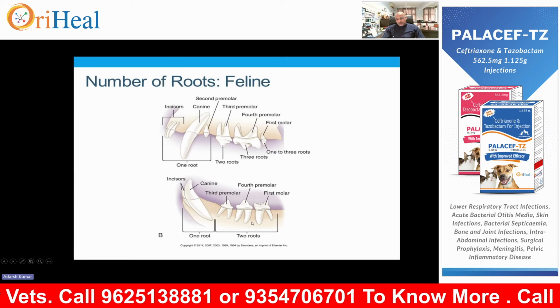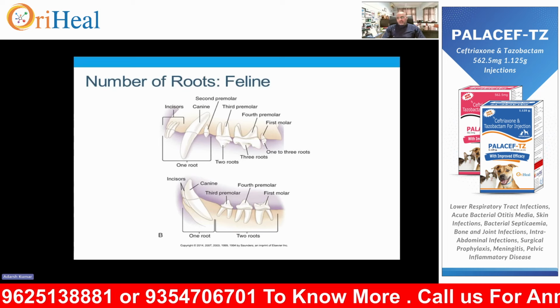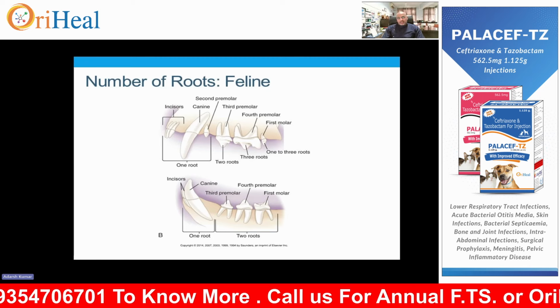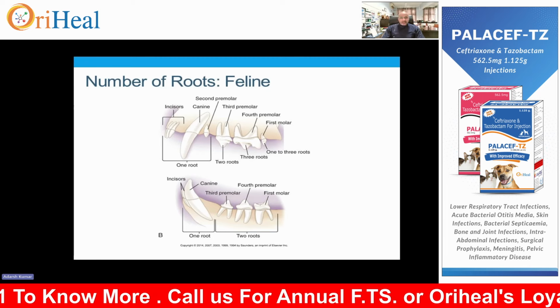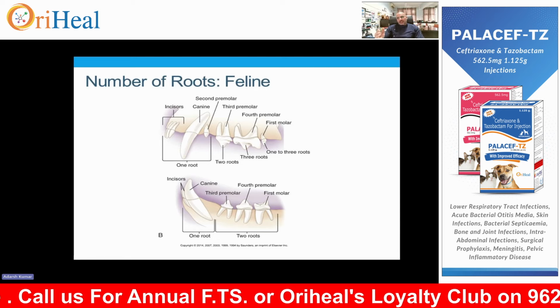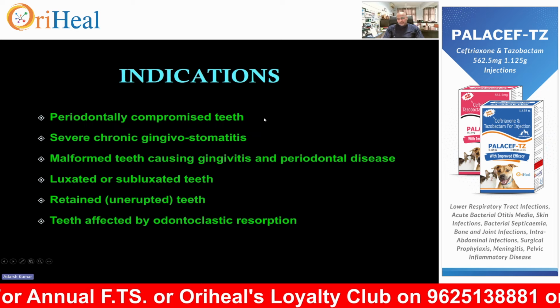Okay, so when you keep this picture pasted on your OT or on your dental desk, it would be easy for you to find out what teeth you are working upon and how many roots are there, because knowing the number of roots becomes very important, because then you have to extract a single root by sectioning the tooth.